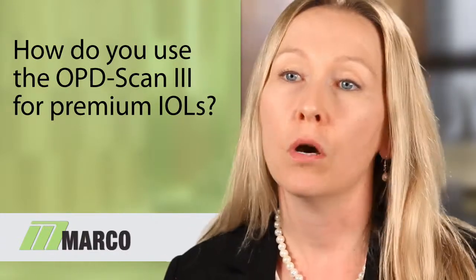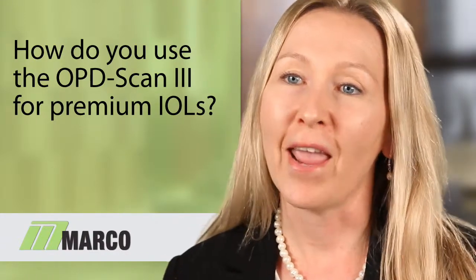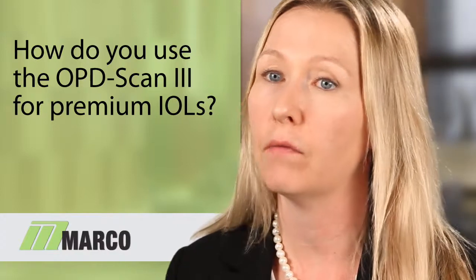A lot of people forget to look at the pupil size, and that is an important factor when it comes to premium IOL implantation. So that picture of a pupil with angle kappa included really reminds you of the patient's size of the pupil. And so you've got two pieces of information that are very important when looking at this patient and whether they're a candidate. You look at pupil size and you look at the angle kappa, and you can determine if the patient would be a good candidate for premium IOL implantation.